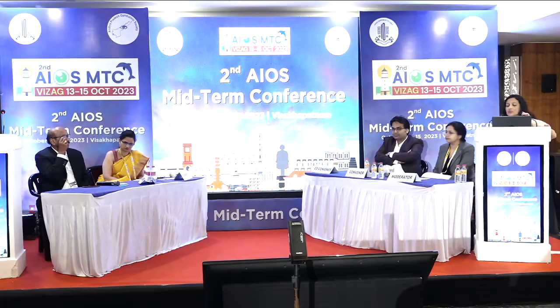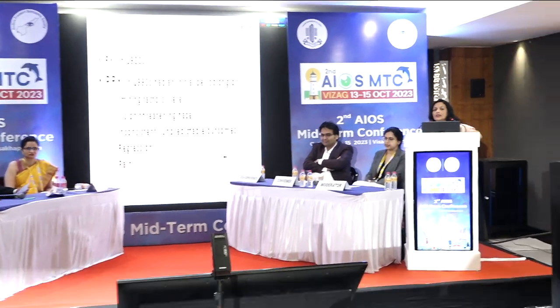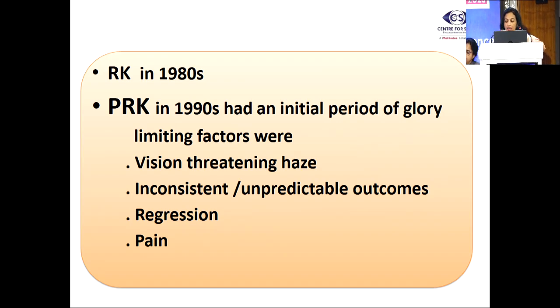So my topic is PRK revisited. Why do I say so? Once radial keratotomy went into disrepute in the 1980s, PRK had its initial period of glory, but then there were limiting factors in the form of vision-threatening haze, inconsistent and unpredictable outcomes, regression and pain.